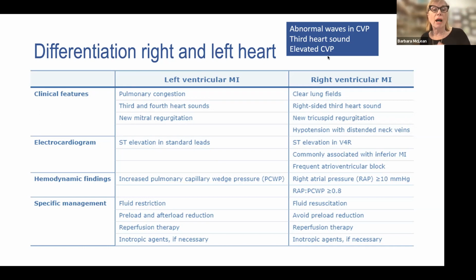So I work by 5s, right? 0 to 5. If your CVP is 0 to 5, here's the only time where CVP can be used for indication of volume. If your CVP is less than 5, your patient is probably hypovolemic. From 5 to 10, we're going to consider that to be essentially normal.